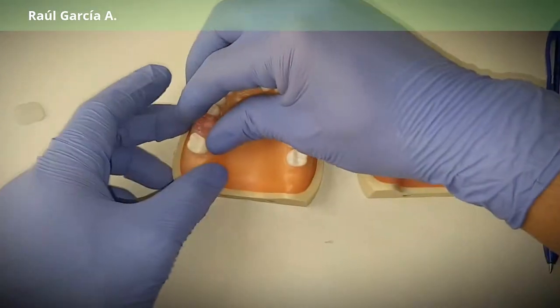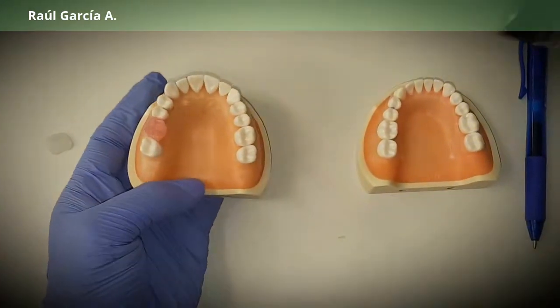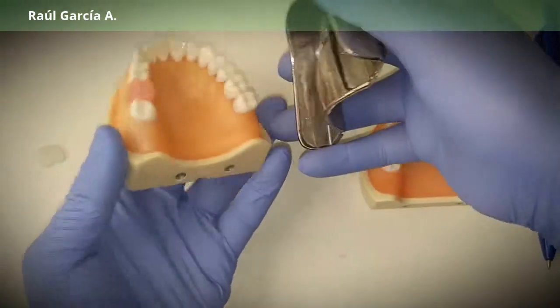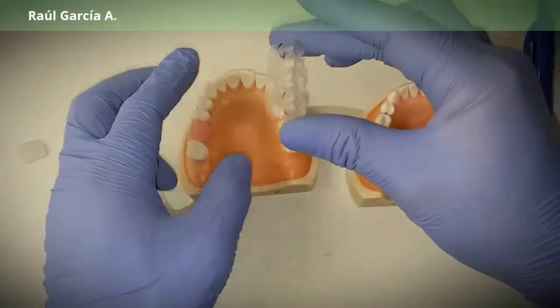I already did a wax-up here. Then what you're going to do is take an impression, duplicate the model, and then take it to the vacuum shell to make your temporary.